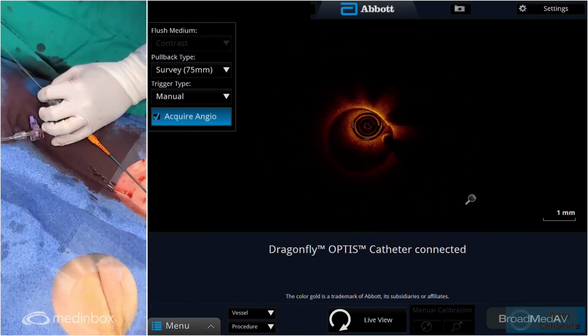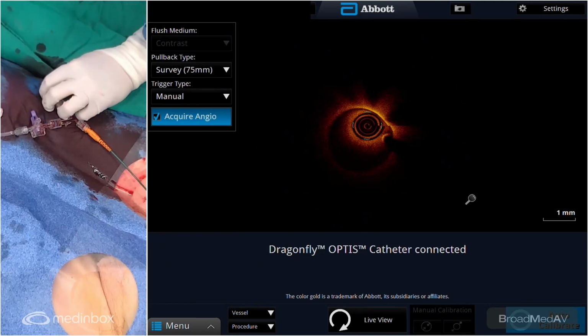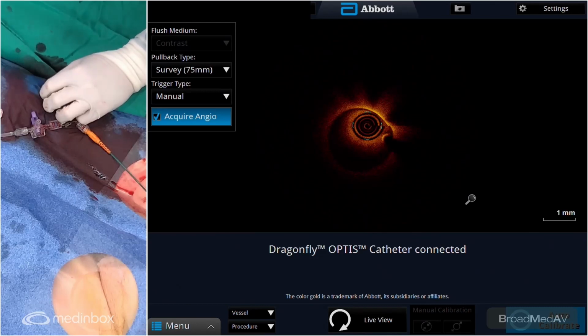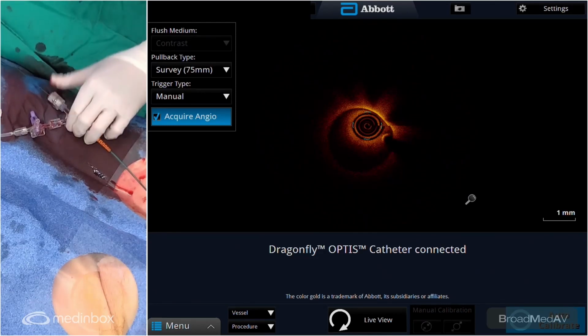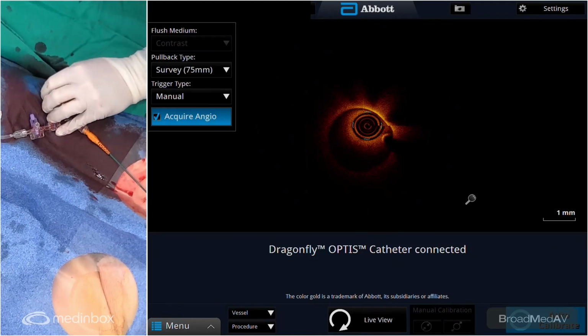Our sense from the angiogram is the entire vessel is pretty calcified, although you can see some stenotic dilatation post lesion and is quite calcified as well. You can see the tram tracks on our diagnostic angio. Can you guys see the live angio with the cine running? You can see the entire vessel is heavily calcified with two spots that are two nodules of calcium. I think that's where the OCT was getting stuck. We'll see how this balloon goes.